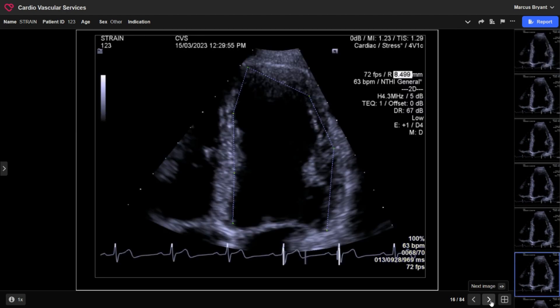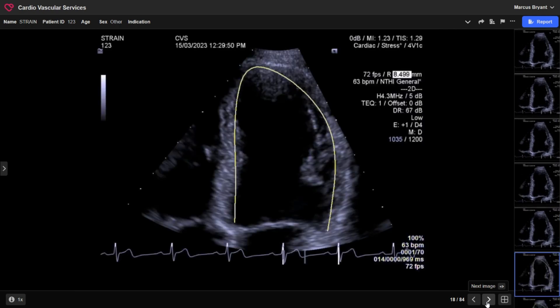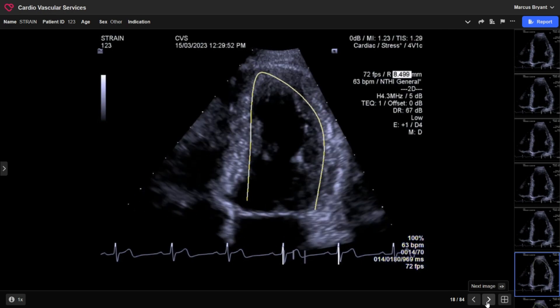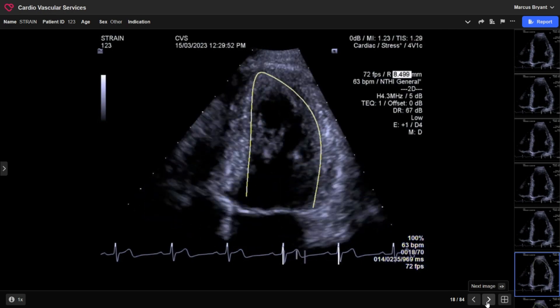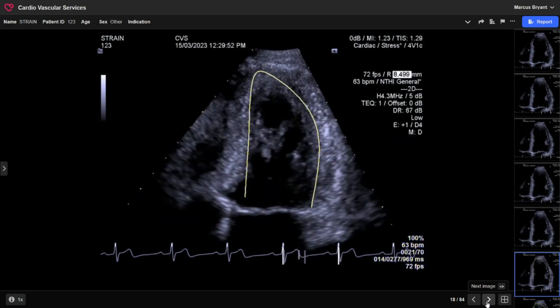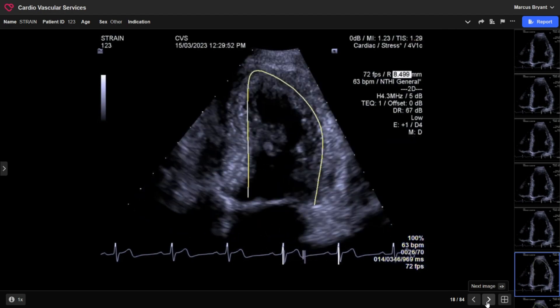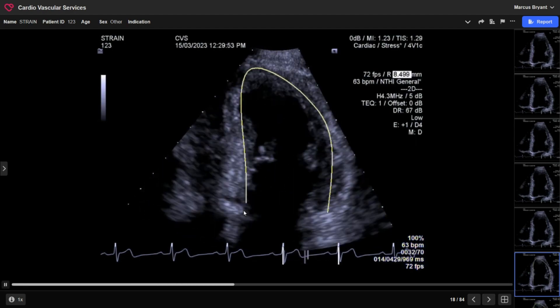So I place my first point there, second point there, third point there, one up at the apex, one across, one down, and another one down. It really doesn't matter if you're crossing over or missing sections - in essence it will find what it wants to track. Then at this point I'll run the image, and I'll actually remove the vector velocities so I can just watch it track through the cycle.